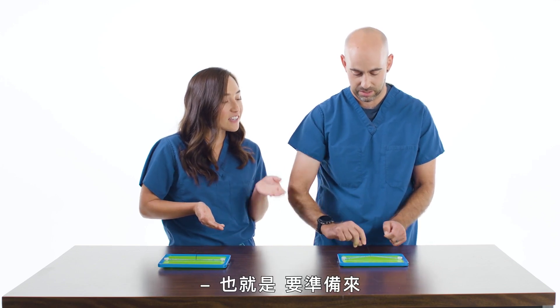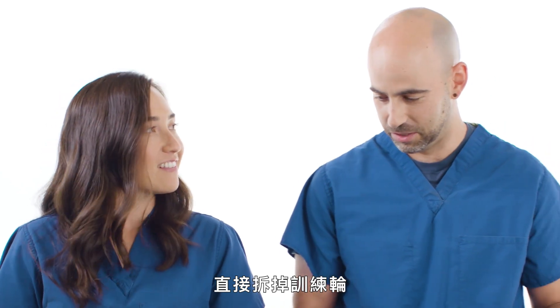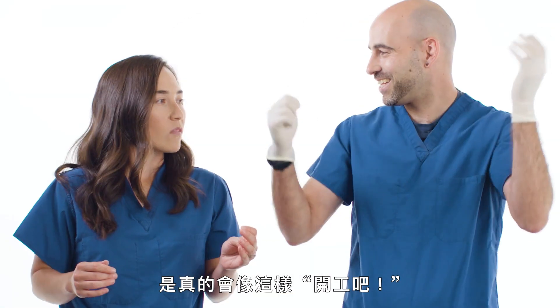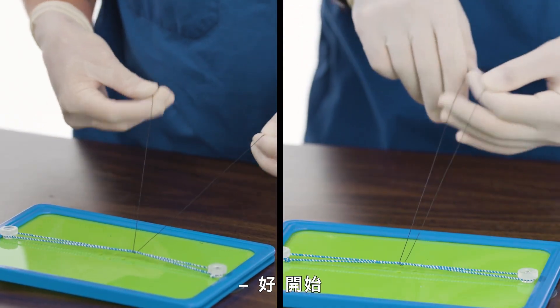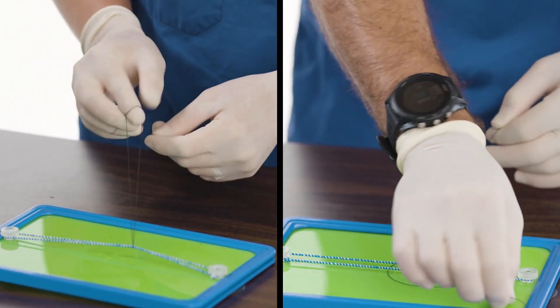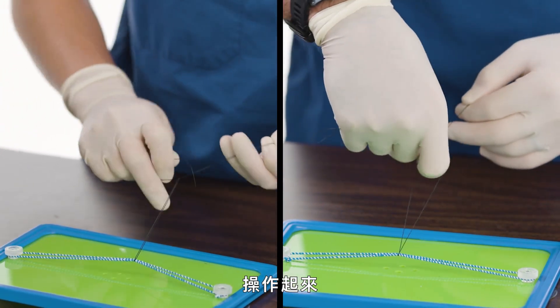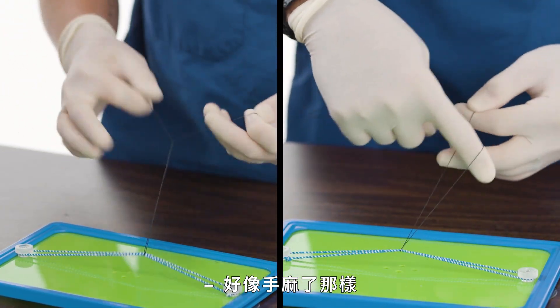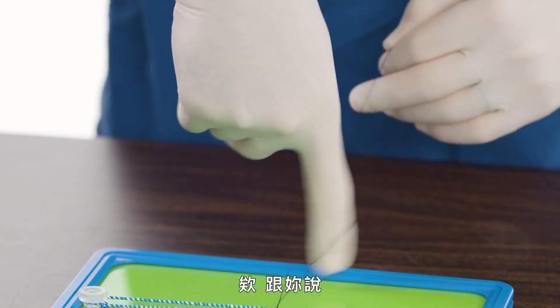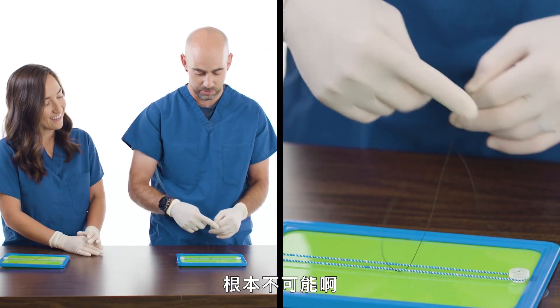I think you're ready for the next curveball — let's get you to do this with gloves on. There's no in between; it's going from the training wheels to the Grand Prix. Do doctors actually do the thing where they're like, let's do this? Oh, 100% every time. So this is just going to be the same thing, the same knots — I just want you to get a sense for how it feels different when you can't feel the suture material directly on your skin. It's almost like numbness. I'm even more terrible.